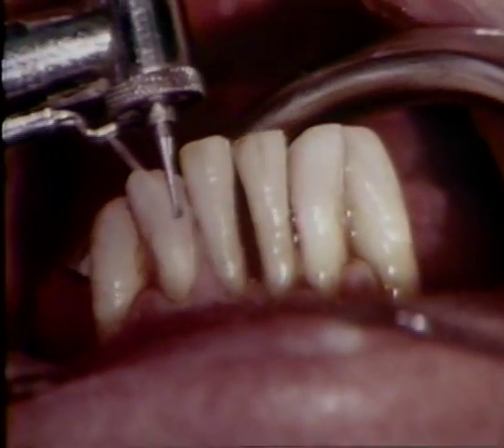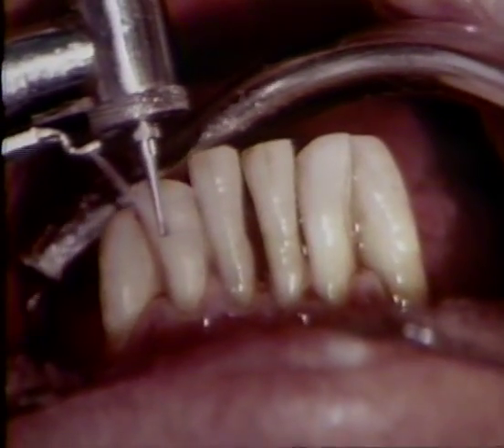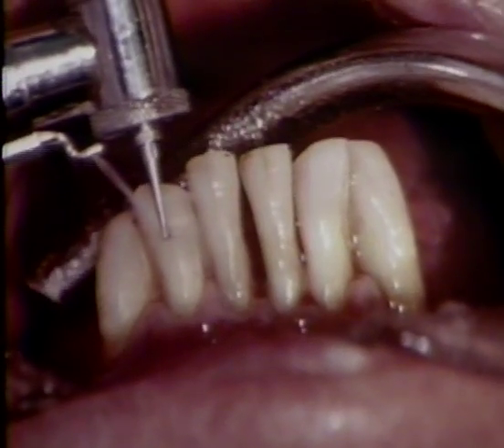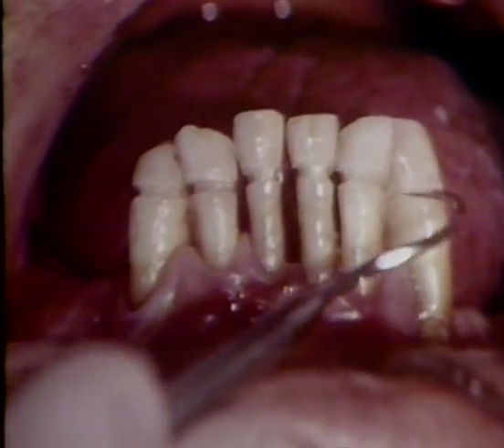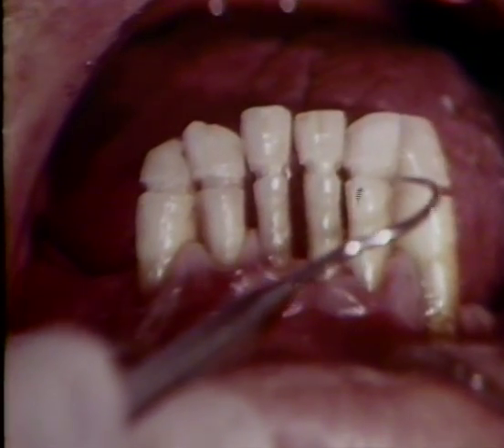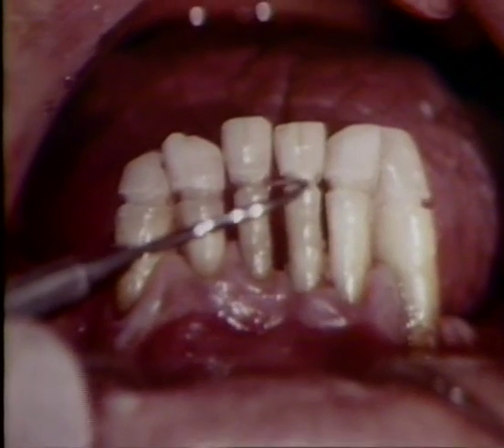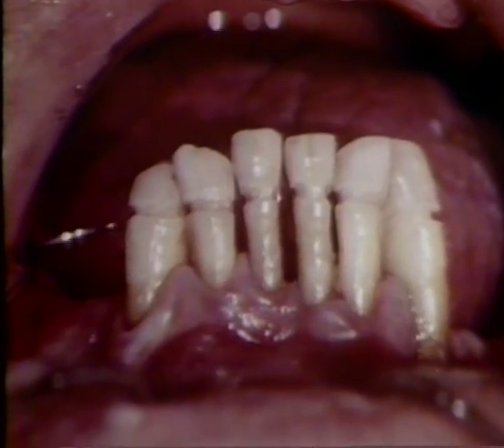A circumferential groove is cut on the labial and lingual aspects of all remaining teeth. The central incisors will be removed because of the extensive loss of their supporting and alveolar bone. The crowns can remain in the splint, but their roots must be sectioned from the upper half of the teeth and removed. The sockets are then allowed to heal, and the natural crown of the tooth becomes the pontic.